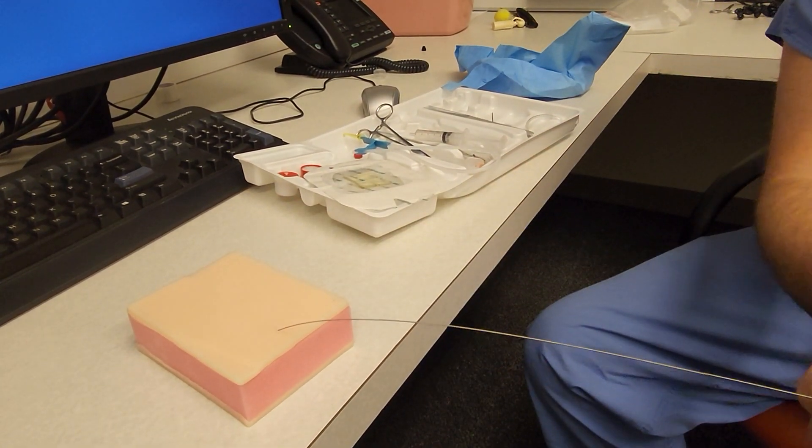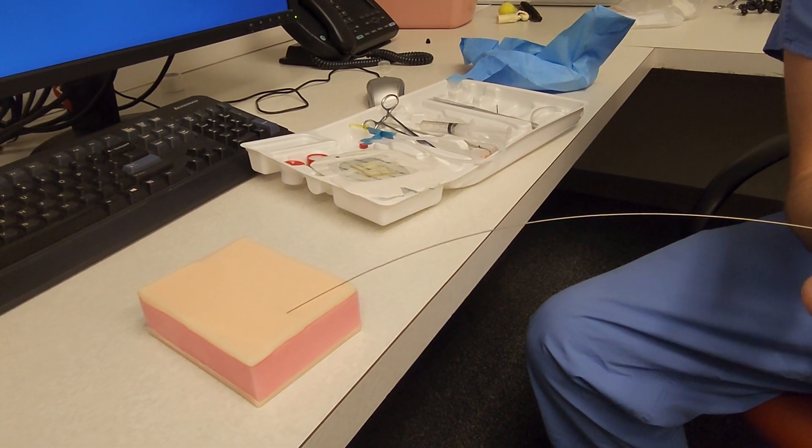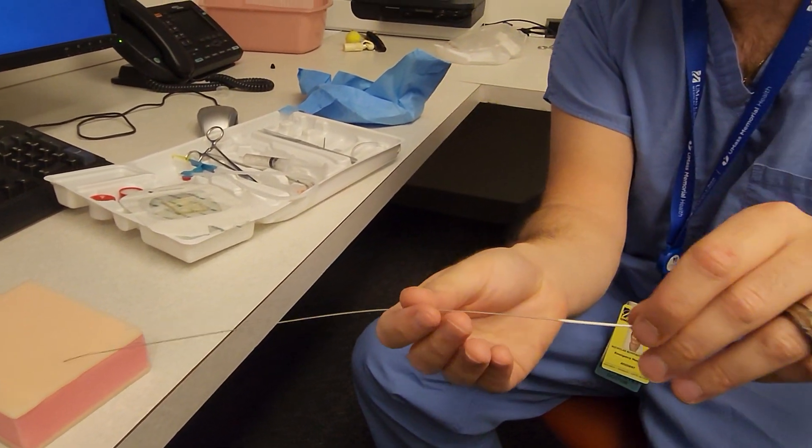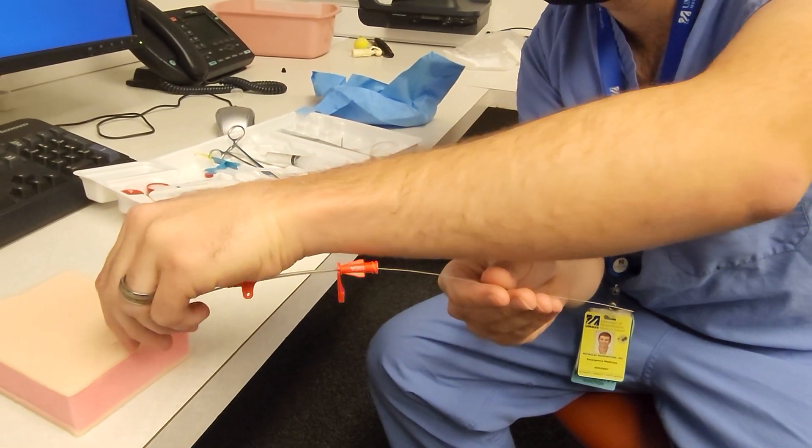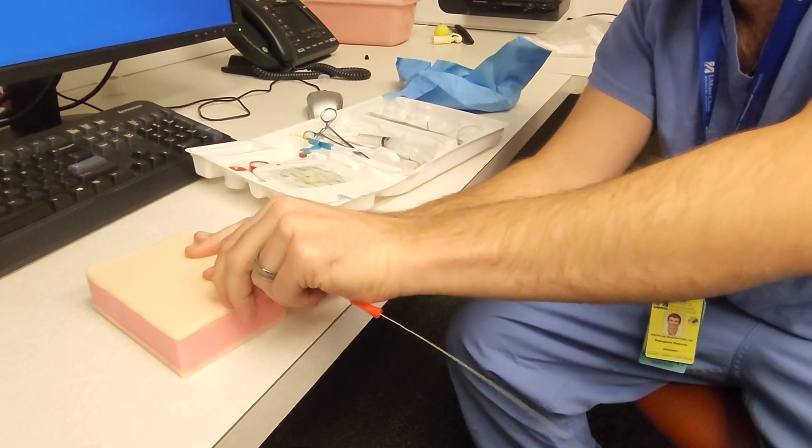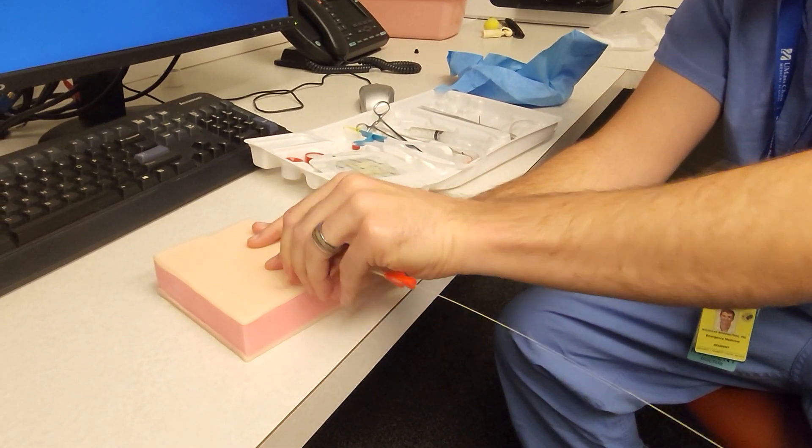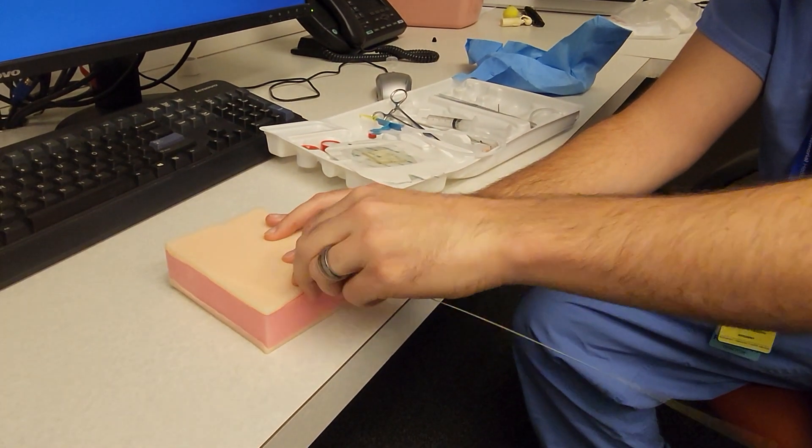And then take your arterial line, thread it over the wire so it's snug.